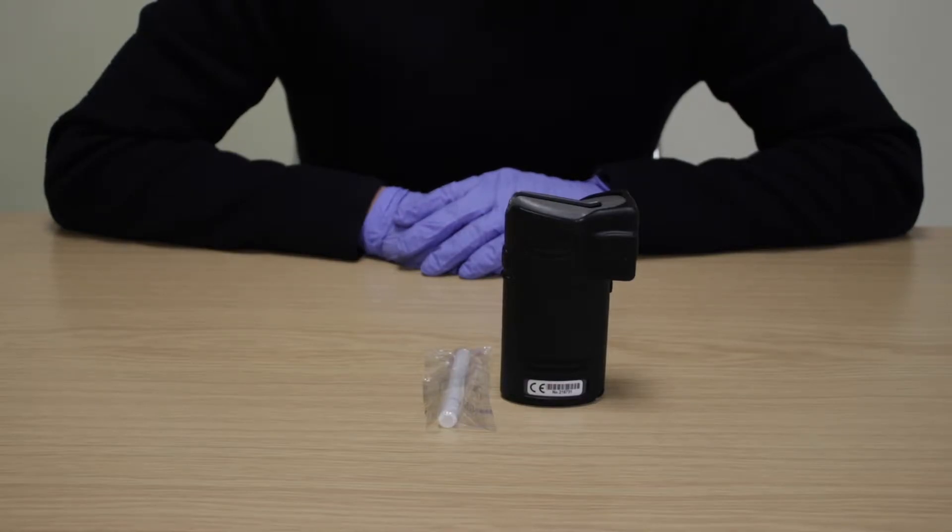The AlkaSensor FST uses fuel cell technology to analyze and convert alcohol molecules to a breath alcohol content. This durable and easy-to-use device is designed to conduct a test using automatic or manual breath sampling, and can perform passive alcohol testing on subjects. It also comes with a drink sniffer accessory that allows the operator to detect alcohol in drinks. The device may or may not come with a printer.